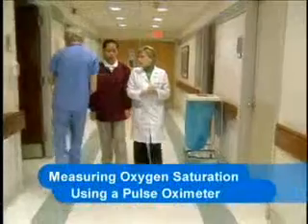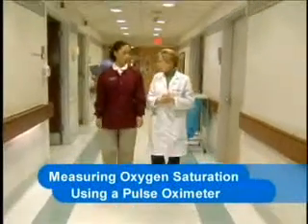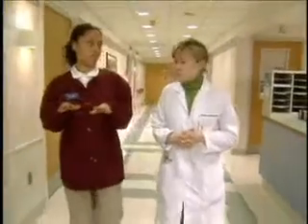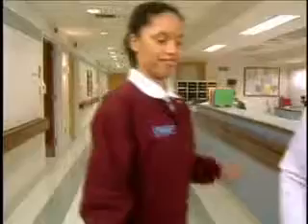Okay, so tell me about your patient. Well, we're monitoring my patient's oxygen saturation to assure he's maintaining adequate oxygenation. Does the order include parameters? Yes, it does. We're to titrate the flow rate of his oxygen to keep his saturation at or above 92%. I think that means we're to adjust the rate, right? Right, very good. And we're to call the physician if his oxygen saturation drops under 92%. Okay, let's go check his oxygen level.